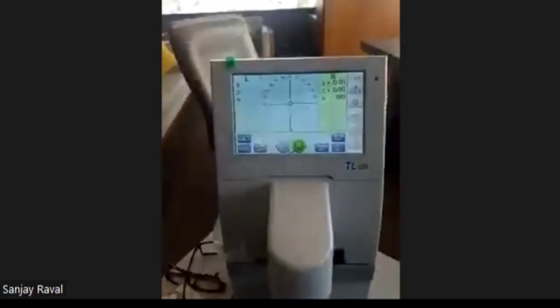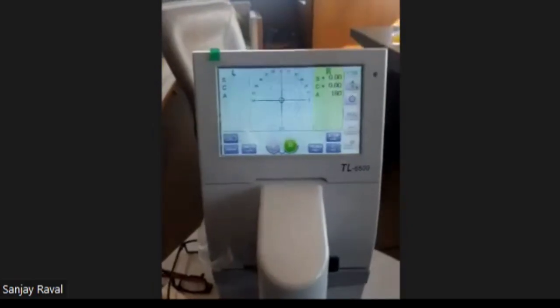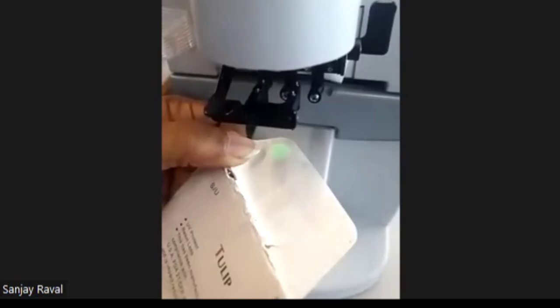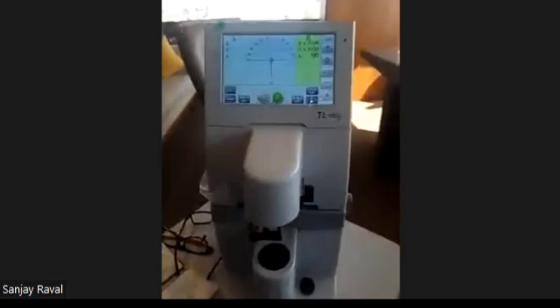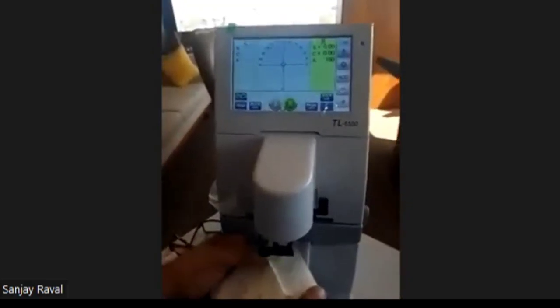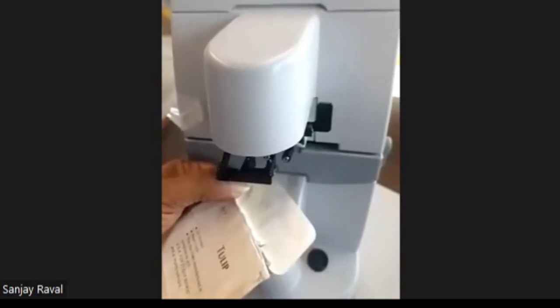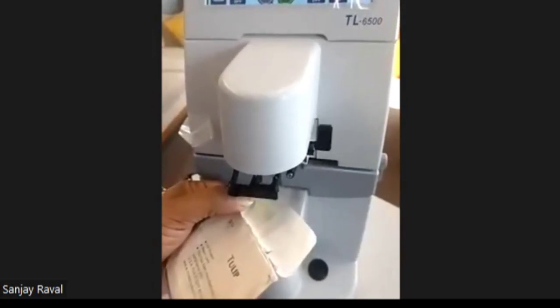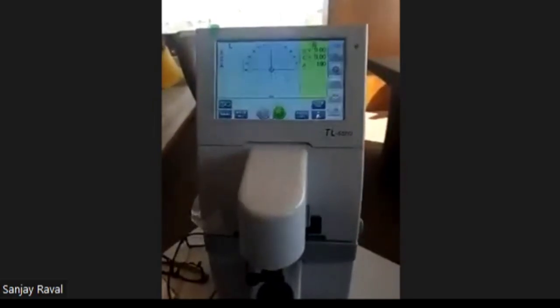Coming down to the routine measurement. First of all, I'll just show you one good thing, the technology of this machine. You can see this green light. I believe everyone can see the green light, and we are changing the intensity of the light. So this machine works on the Hartmann-Shack principle, the wavefront principle. In a single beam it measures 145 measurement points. So the entire offered area is measured at 145 different points, and Hartmann-Shack is one of the most trusted and approved measurement analysis patterns, the wavefront pattern, right?